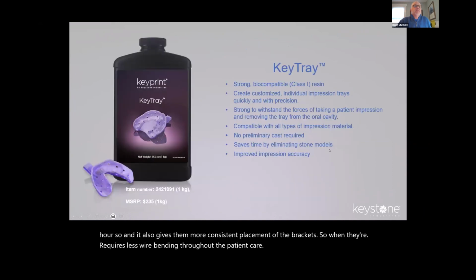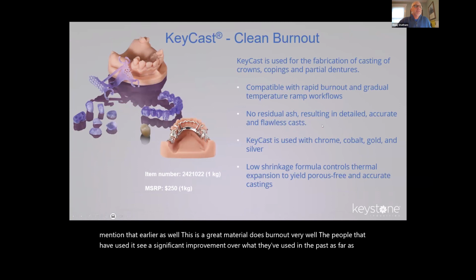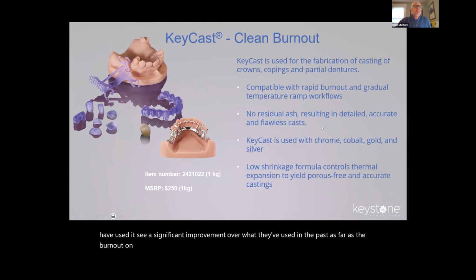Some of the lab resins: we talked about the tray material and the wax-up material, which we did mention earlier as well. This is a great material. It does burn out very well. The people that have used it see a significant improvement over what they've used in the past as far as the burnout, and it prints very, very accurately.